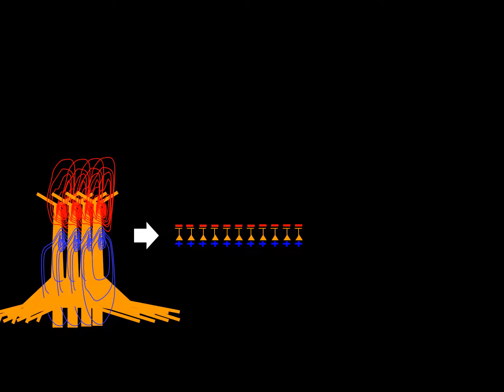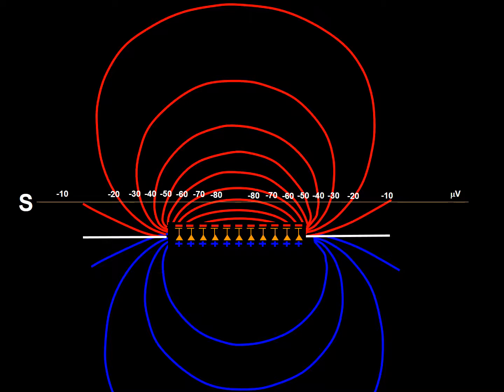If you recall, I presented this diagram before in this talk when we discussed isopotential lines, and also this one when we were talking about isopotential lines and contour voltage fields. At this time, I will use this diagram to show you the relation between solid angle, isopotential lines, and wave amplitude. In this frame, I have represented a wave viewed from the position of an electrode in a specific area. Now I have exchanged the position of the electrode, keeping the distance but changing the angle. This change results in a higher amplitude wave.